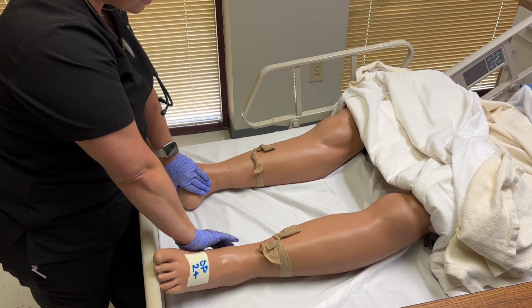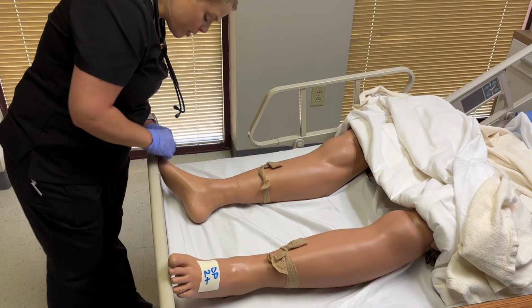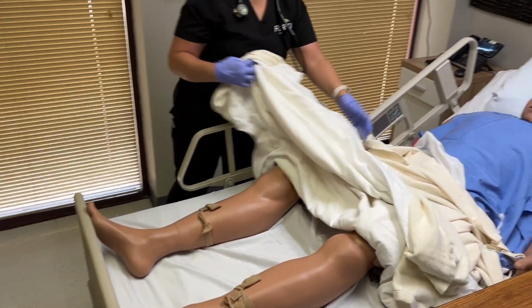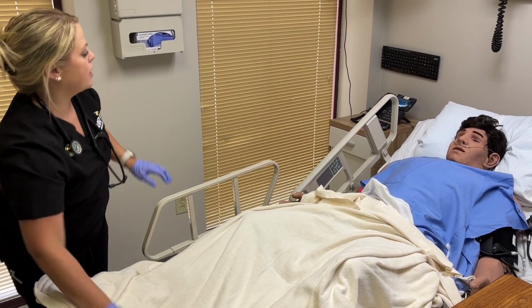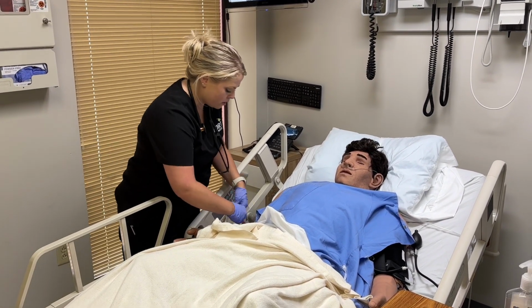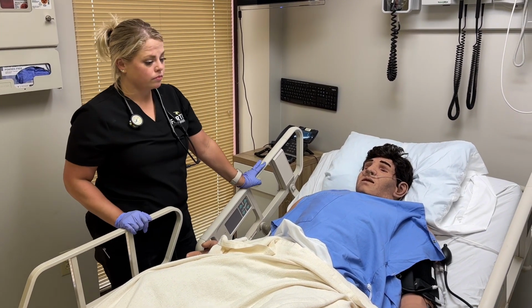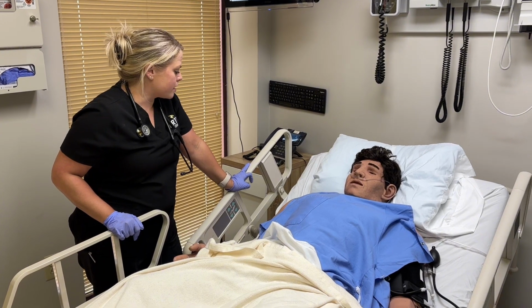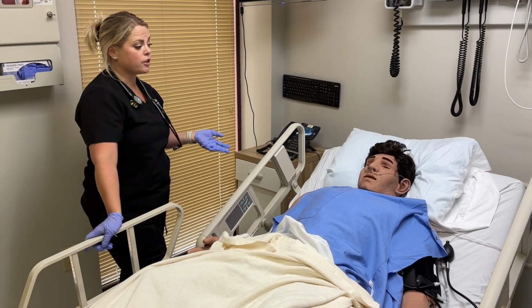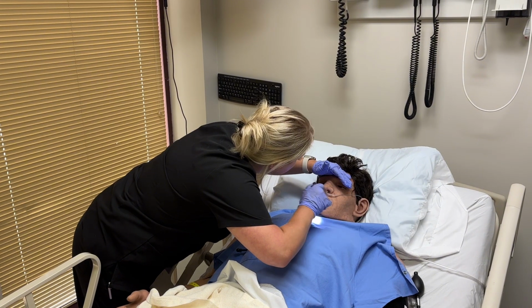And the posterior tibials, also 2+ and equal. Capillary refill. Less than 3 seconds. Okay. Alrighty. And ideally we have our tele monitor on, so I would identify his rate and rhythm. So he is sinus rhythm. Okay. And rate is 75. Okay. All right. So I'm done with my respiratory and my cardiac. So I'm going to finish up the rest of my head to toe now. All right. So with my penlight, I'm going to assess pupils. They are round.